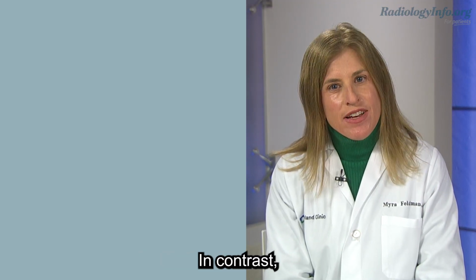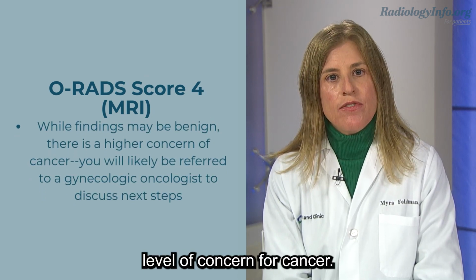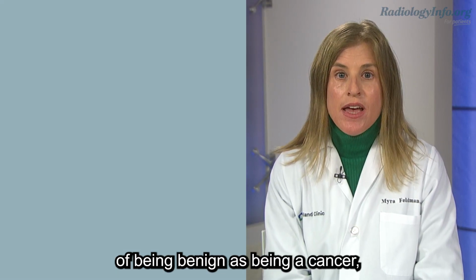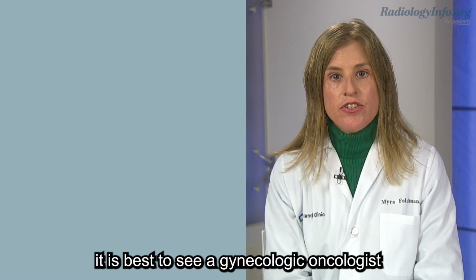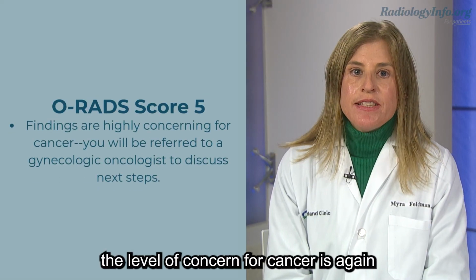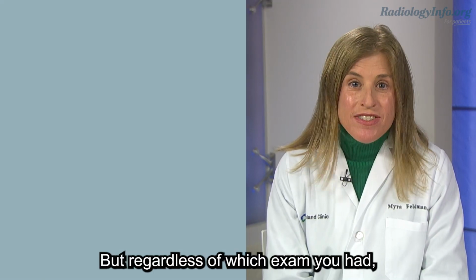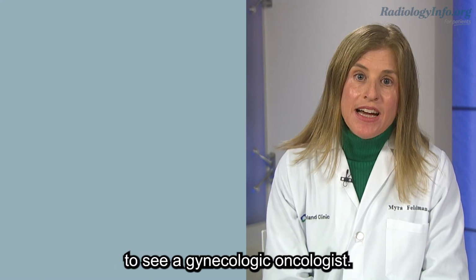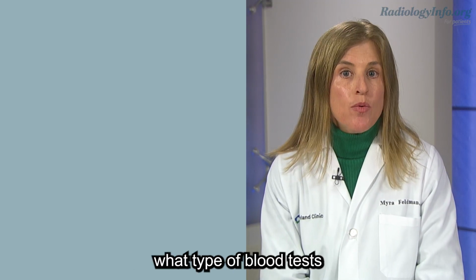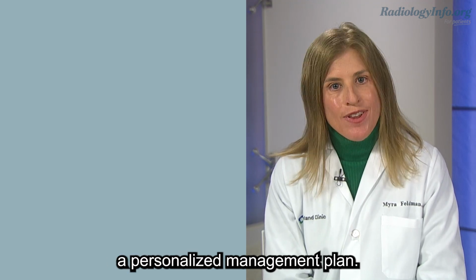In contrast, a score of 4 in an MRI exam report carries a slightly higher level of concern for cancer. While the lesion has an equal likelihood of being benign as being a cancer, it is best to see a gynecologic oncologist to get their opinion. For an O-RADS score of 5, the level of concern for cancer is again higher following an MRI than following an ultrasound. But regardless of which exam you had, it is recommended to see a gynecologic oncologist. A gynecologic oncologist is best able to determine what type of blood tests and additional imaging exams are needed in order to create a personalized management plan.